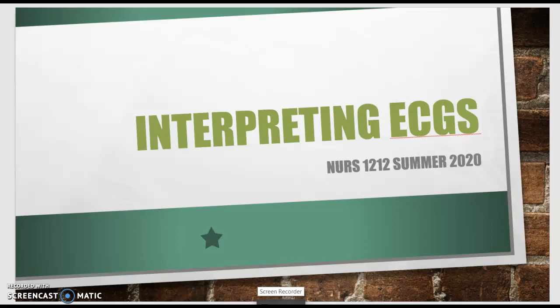Good morning, everyone. I just wanted to open up this PowerPoint for you guys and talk through interpreting EKGs or ECGs so you guys have a little bit of a better understanding and you don't have to listen to Sarah on rn.com.